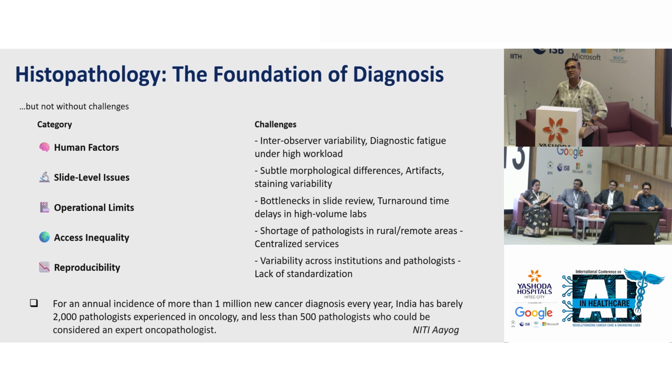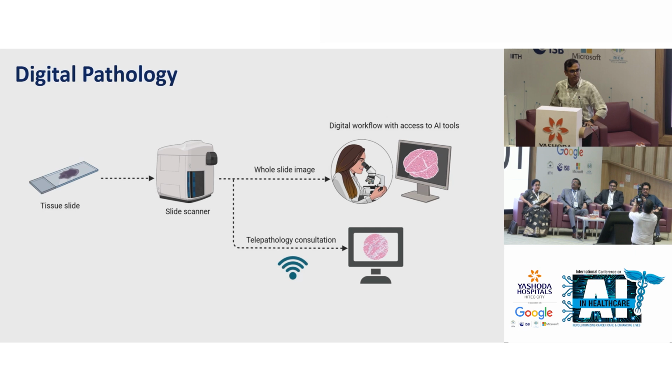How do we overcome these challenges is what I'll discuss in the next 10 minutes. For this, we are looking at digital transformation, which we discussed in the morning session, called digital pathology, where you take the tissue slide images and put them in a whole slide scanner. This is where a lot more revolution is going to happen in India, and we're already seeing many startups coming into the space with low-cost whole slide scanning systems, which could help us move from looking under the microscope to looking at a computer. And once you digitalize, then comes the interesting aspect of what you can do with it.